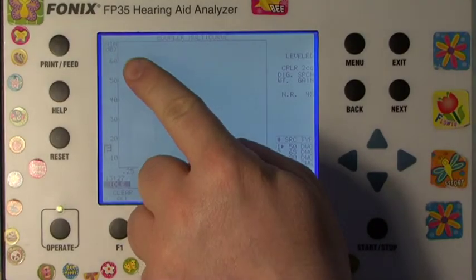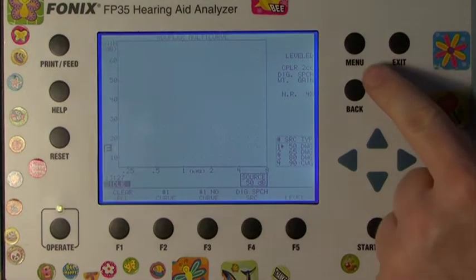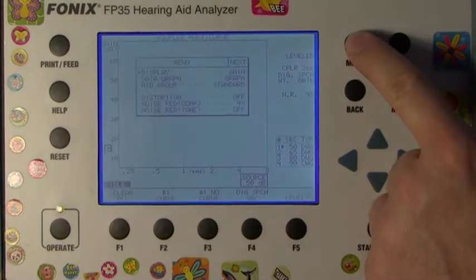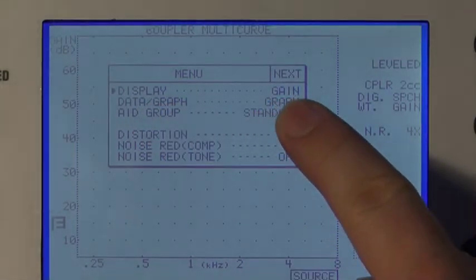On the screen in the top left it should read SPL for sound pressure level. To change this, press the menu button. A small menu on the screen will be displayed, and on the menu display is Gain.